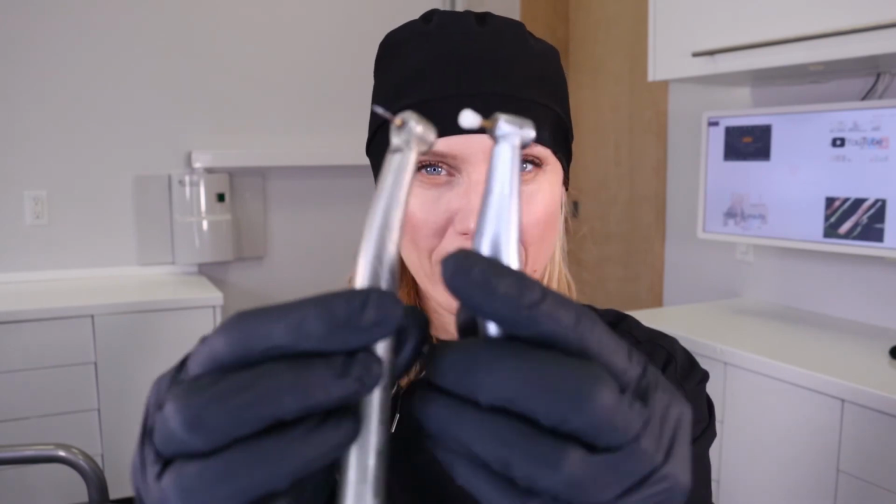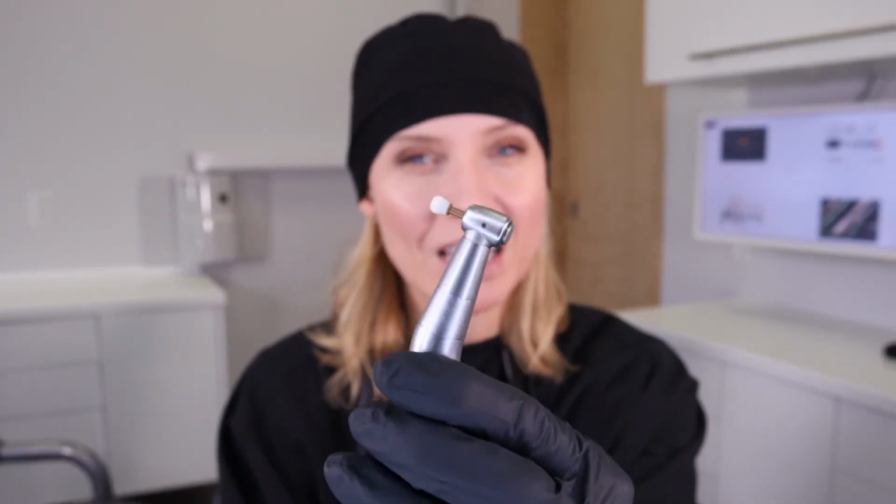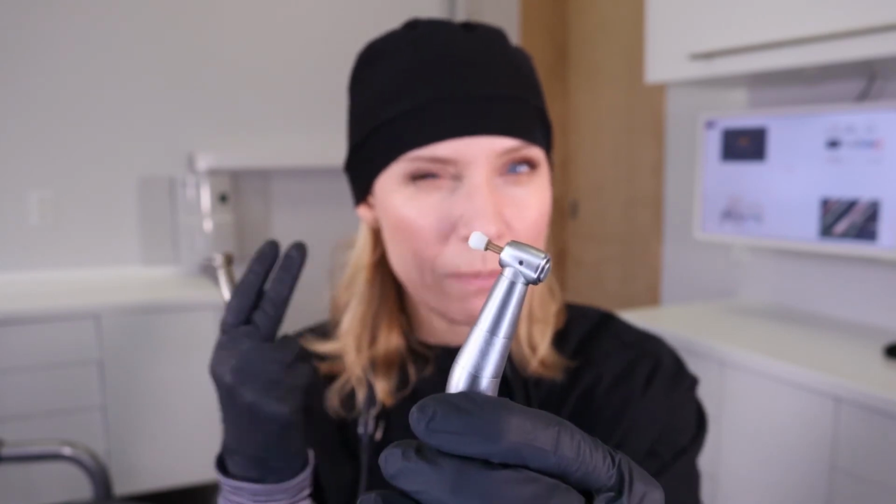And the difference it makes to the patient, so ultimately you as a patient, you probably are like, just fix my tooth, I don't know. But what it will be is that the one on the right, the skinnier one, the one that's smaller, is actually going to be less vibration, but it's going to be a lot louder. And the one on the left, the slow-speed one, is going to be a little bit less loud, less high-pitched, but it's going to be much more rumbly. So we always say, it feels like a little rumble in your tooth, a lot of vibration. And people who are sensitive to vibration and things like that certainly may have more problems with that.